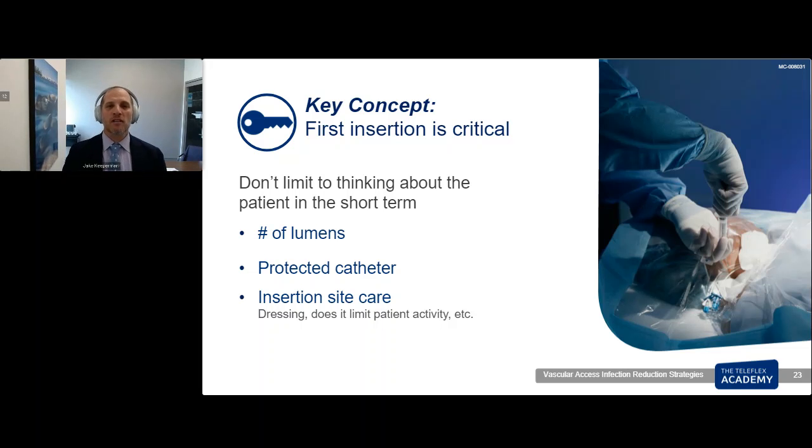Make sure that you are putting the appropriate barrier there, such as a BioPatch. Make sure that you are appropriately cleaning the site, and make sure that your dressing is clean, dry, and intact. Remember, often the only part of a procedure that a patient or their loved one sees is the dressing. So make sure it's clean. Use chlorhexidine to clean off a little bit of the blood that might develop there. Treat your patient how you would want you or your loved one to be treated.